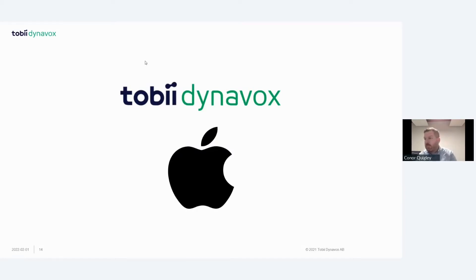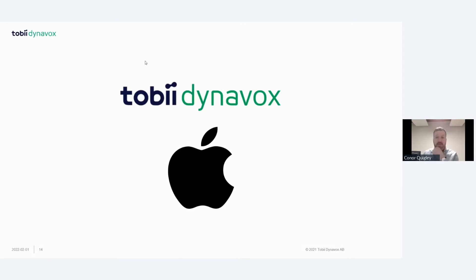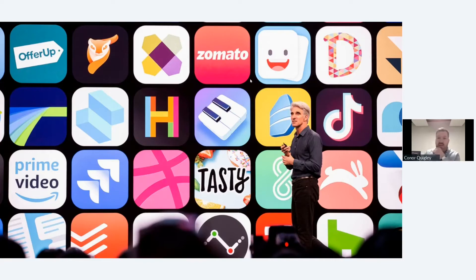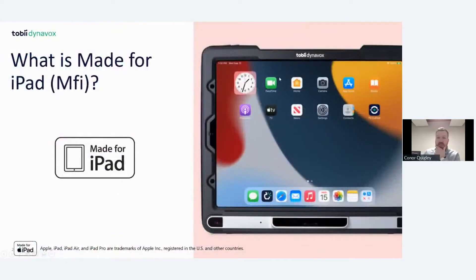Tobii Dynavox has been working with Apple for a long time to integrate eye gaze through the assistive touch functionality on an iPad. If you're familiar with setting up accessibility settings for mouth control or joystick control, Apple has now integrated eye gaze control via assistive touch. The TD Pilot is the first Made for iPad (MFI) device with eye tracking, and being the only certified eye tracker on the market opens up the entire App Store ecosystem for users.